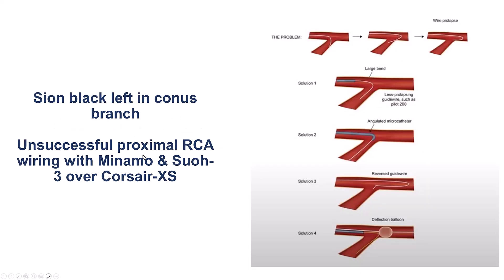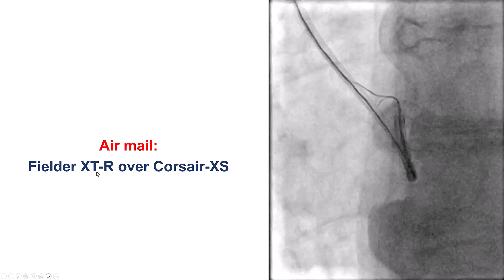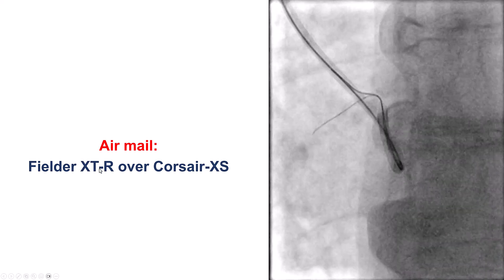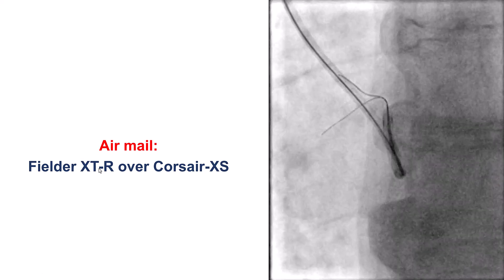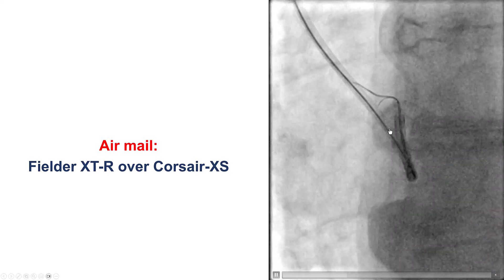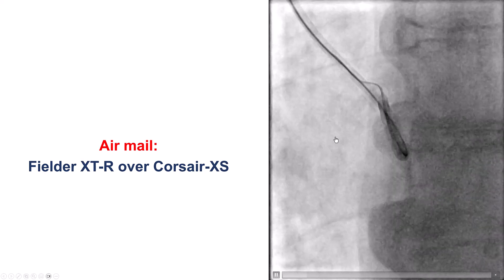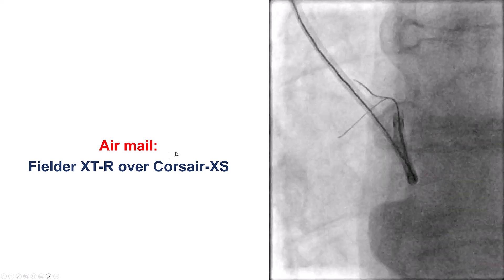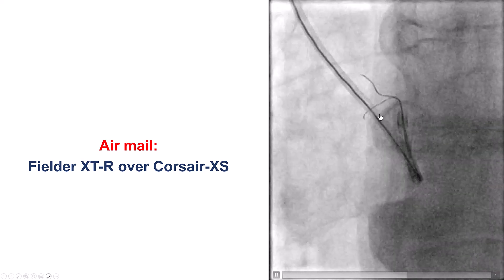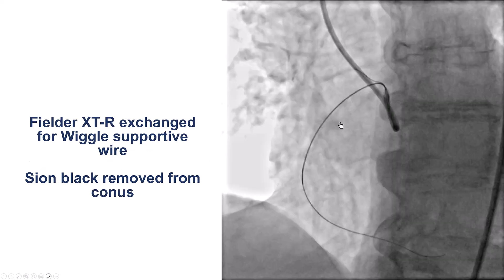We tried different wires — a Minamo Workhorse, a Suoh-3 over a microcatheter, and a standard Corsair XS microcatheter — with no support. Finally, we used the airmail approach. We put a bigger bend on a Fielder XT-R, which is a soft polymer-jacketed tapered guide wire, and were able to advance it across this significant bend into the right coronary artery. We were wiring from below the vessel but were eventually able to advance this wire.